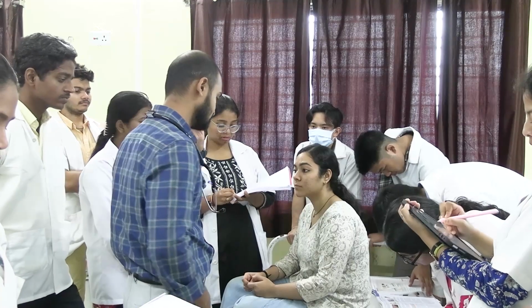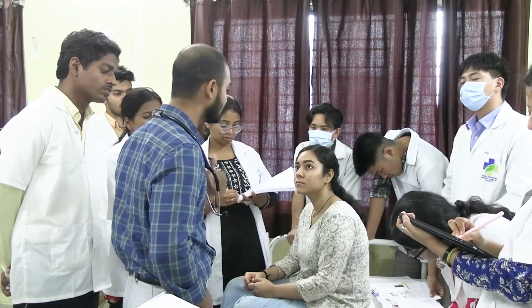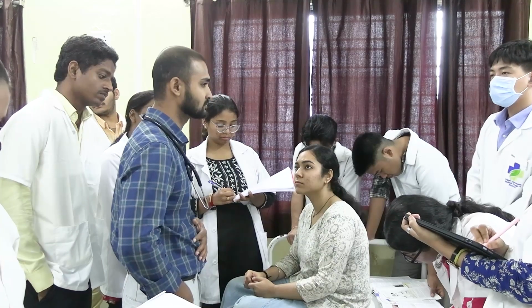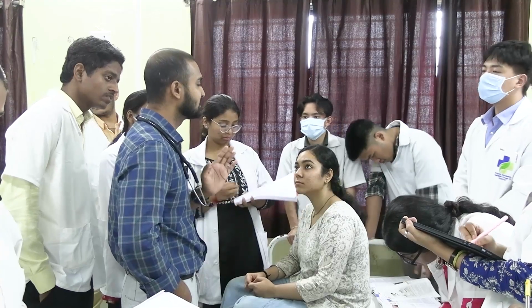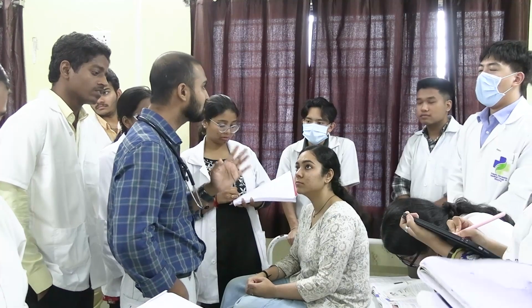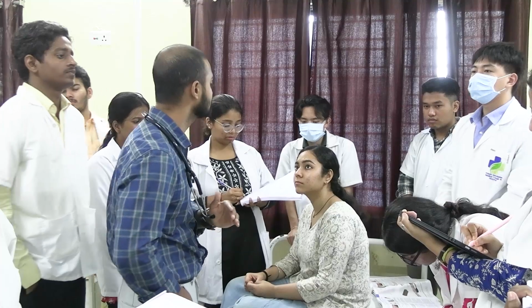Then comes the third phase. The third phase will be loud and clear. This is around 5 to 7 mmHg. The last phase is the fourth phase. This is muffled and dull. You remember the sound, dull? This is a muffled or dull sound, around 5 to 6 mmHg. And then the sound will disappear.